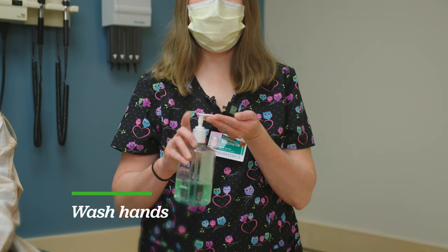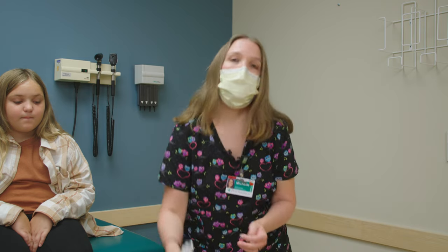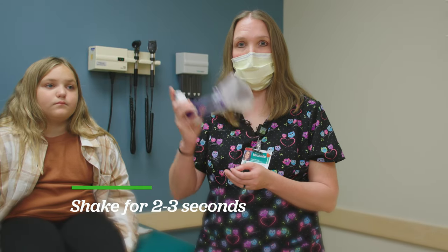First thing you want to do is sanitize your hands. So now we're going to show our patient how to use a spacer mask device with her inhaler. You're going to shake the medicine up really good, two to three seconds.